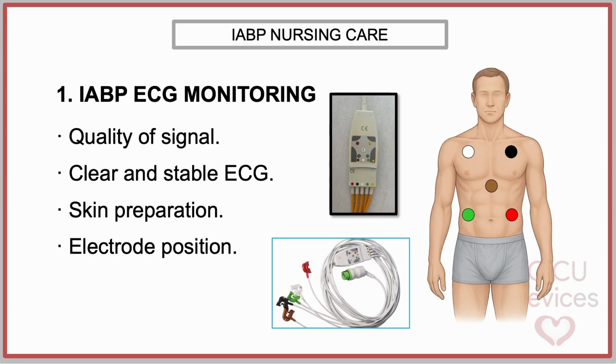To optimize signal quality, ECG electrodes should be positioned according to the manufacturer's recommendations and institutional protocol. Generally, the correct positions are provided either on a diagram printed on the cable itself or in the device's instruction manual. Correct anatomical positioning of the electrodes is fundamental to obtaining a high-quality tracing suitable for triggering.